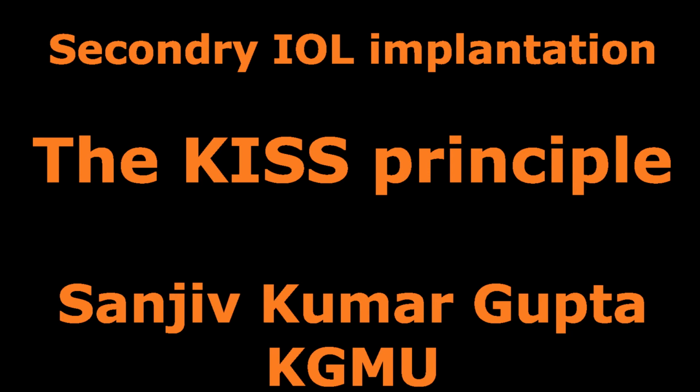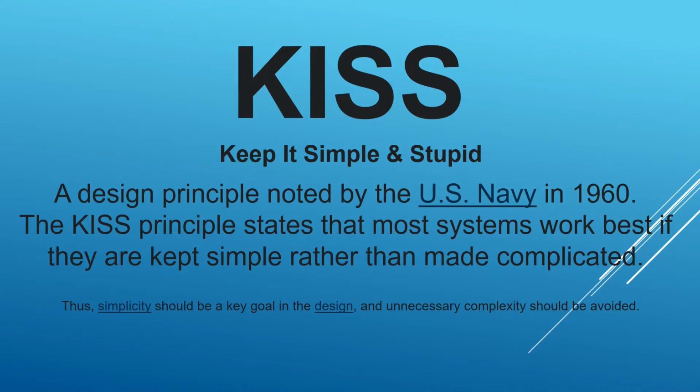Today, with the help of this particular video, I'll put up my views about this debatable topic of secondary IOL implantation when you don't have any capsular support. Now, this is one engineering principle which has been practiced by the US Navy since the 1960s, and here we'll see the utility of this principle in medical science and its surgical implications.